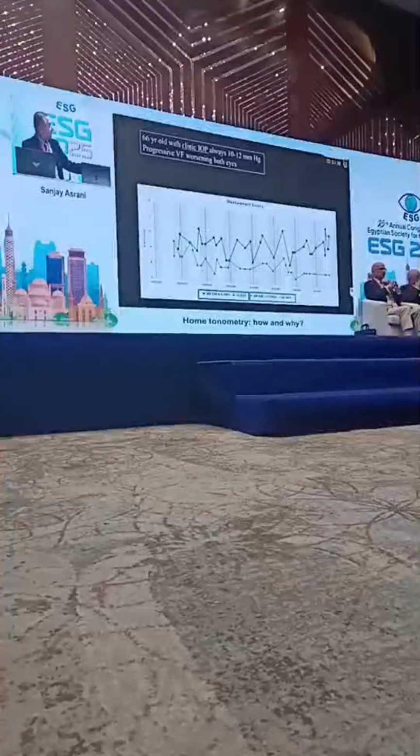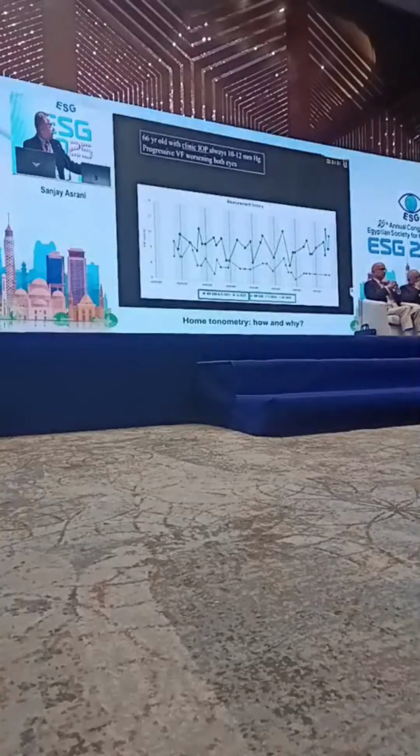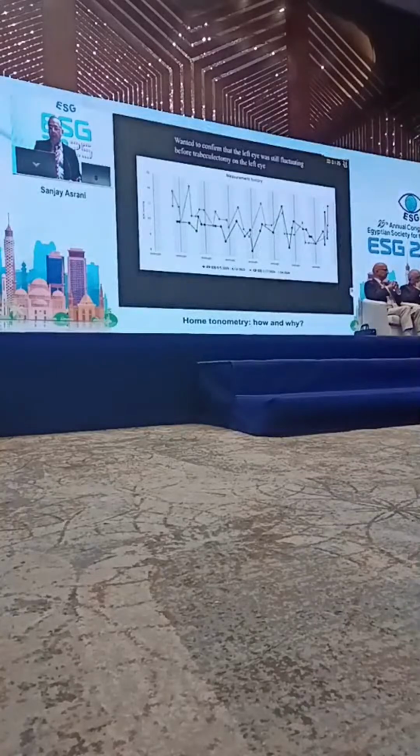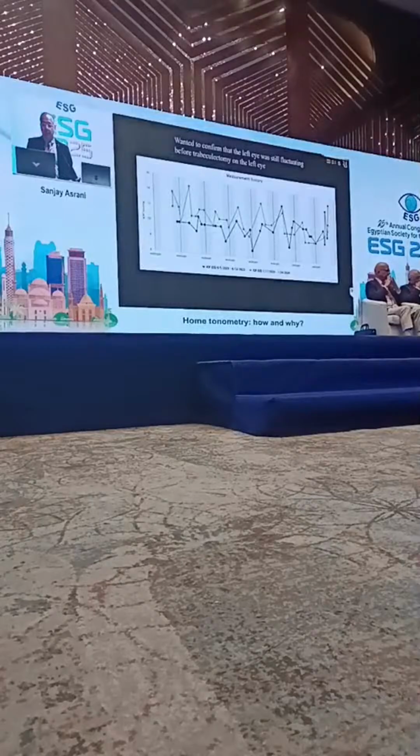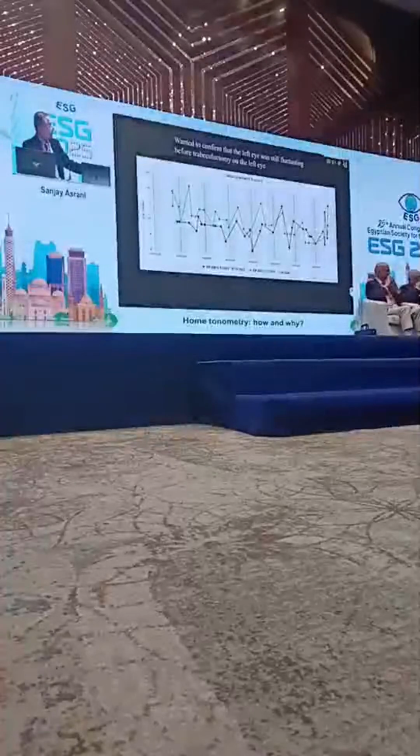And you can see before trabeculectomy how the pressures are changing. After trabeculectomy, they are virtually flat. Then he said, I want to confirm that my left eye is still having fluctuation compared to the right eye. And sure enough, his left eye pressure is in the green, and you can see how it is fluctuating compared to the previous.